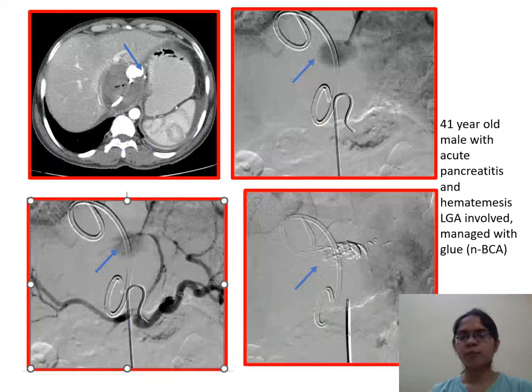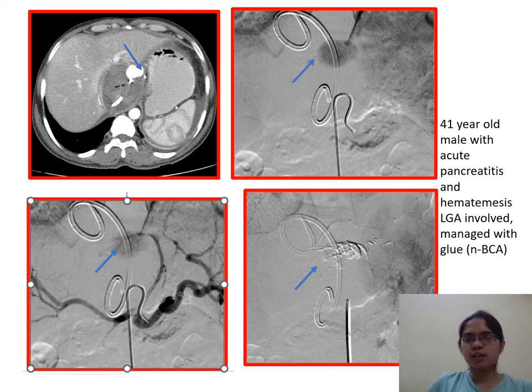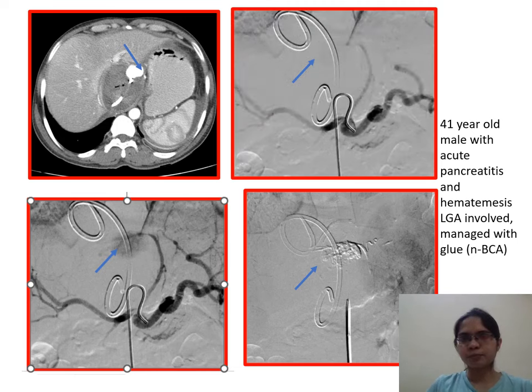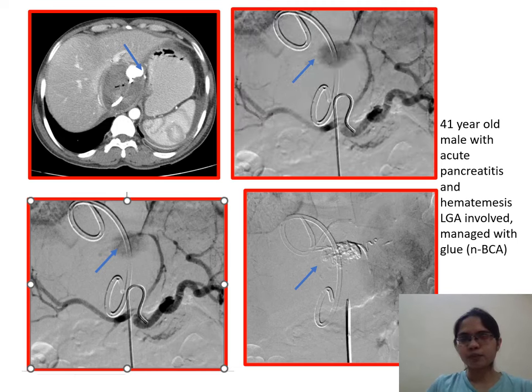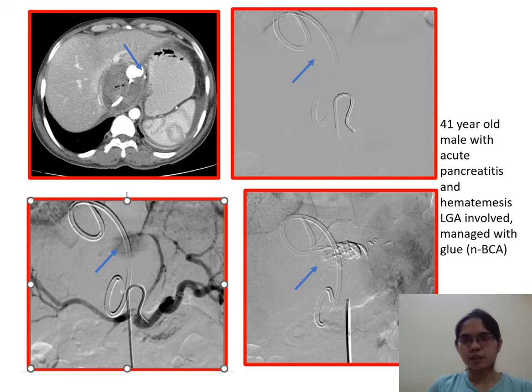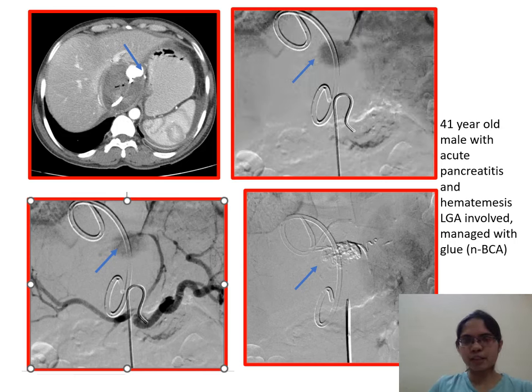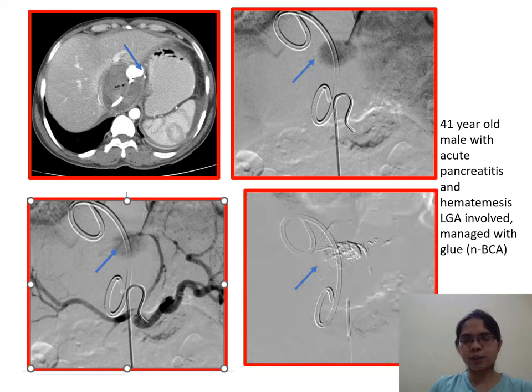Case 1: A 41-year-old male with acute pancreatitis and hematemesis. CT shows a left gastric artery pseudoaneurysm, which was managed with N-butyl cyanoacrylate glue embolization.